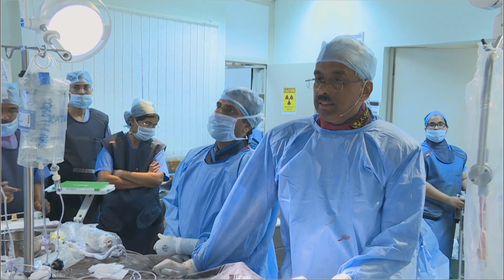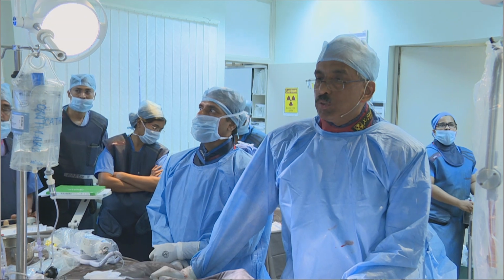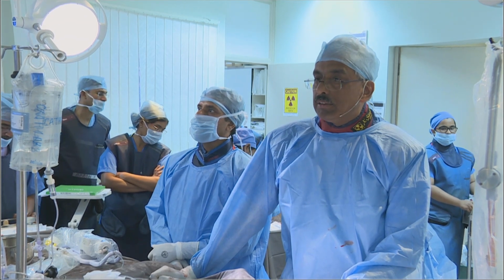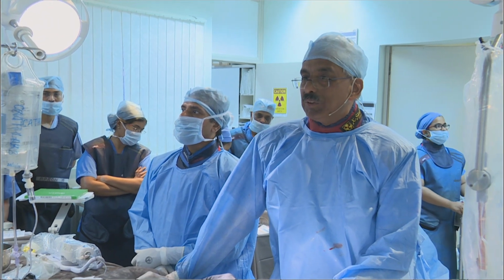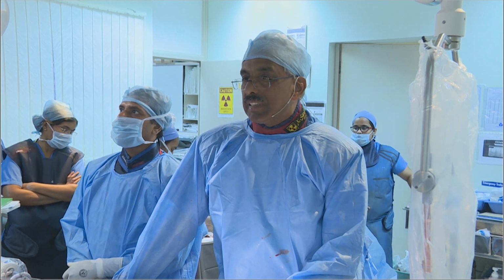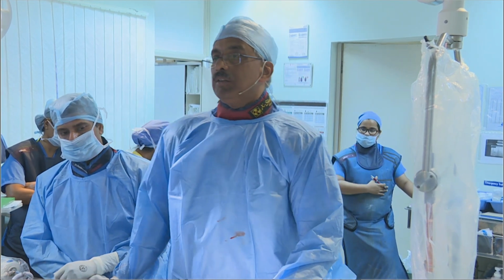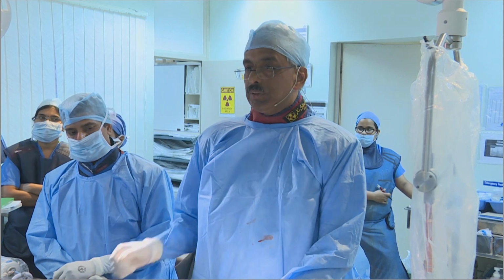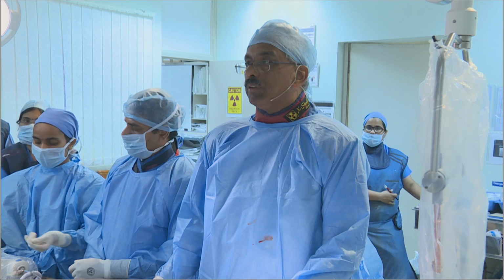There are certain areas where we have cracked the 360-degree calcium with the 2.5 balloon, but I'm still not happy to leave it there and get the stent down yet. I would possibly sculpt this again and have an opening which is wide enough for all the stents to go down. So I think that IVUS helped me for a few things.